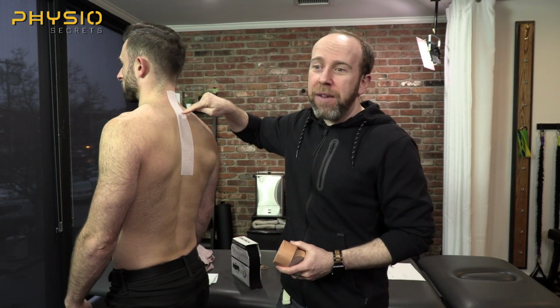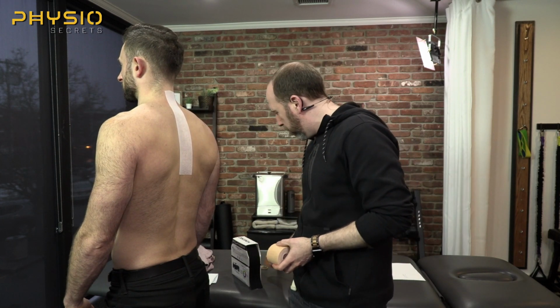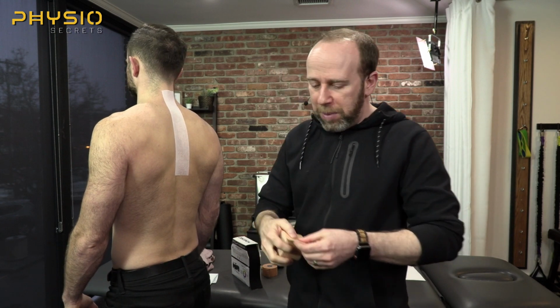This tape, after 3 to 5 days, you'll actually notice it still looks like this. You don't get dirt trapped underneath it. It's just a very different experience for the person. It's much more comfortable. So the last kind of tape is dynamic tape.